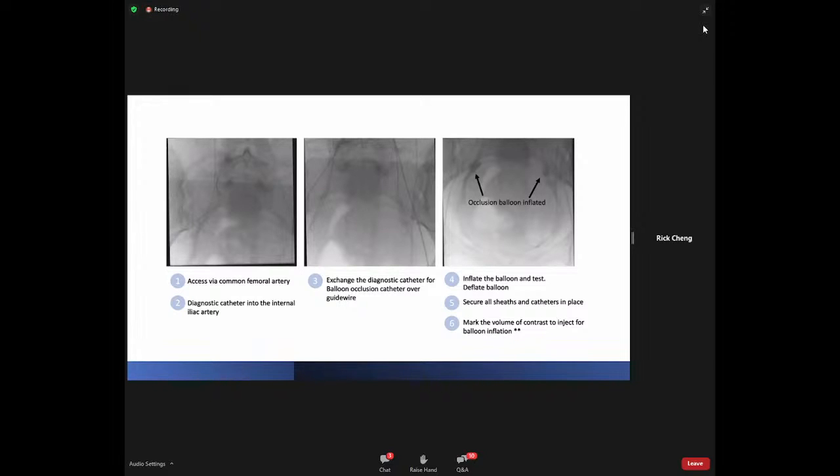The amount that is used to inflate the balloon would be clearly marked and also announced to the team as well. It is very important to make sure you do not overinflate the balloon. So you just want the balloon to slowly conform to the vessel rather than having a very plump, round balloon over-distend the vessel here.